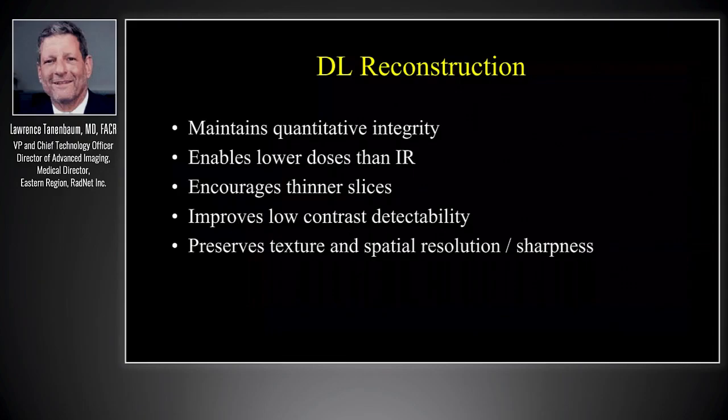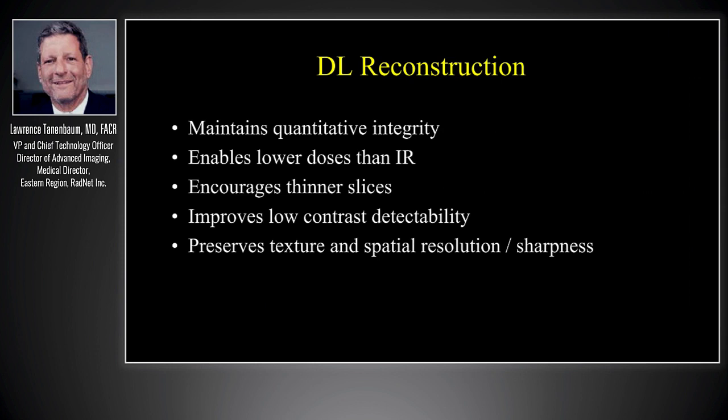So in my 10 minutes or so, I hope I've made the key point that deep learning reconstruction is a revolution in routine imaging, whether it's for CT or MR, but in CT, particularly maintaining the quantitative integrity, lowering the dose even further, encouraging us to think differently and use thinner slices and get better images that do not give up anything compared to our gold standard.